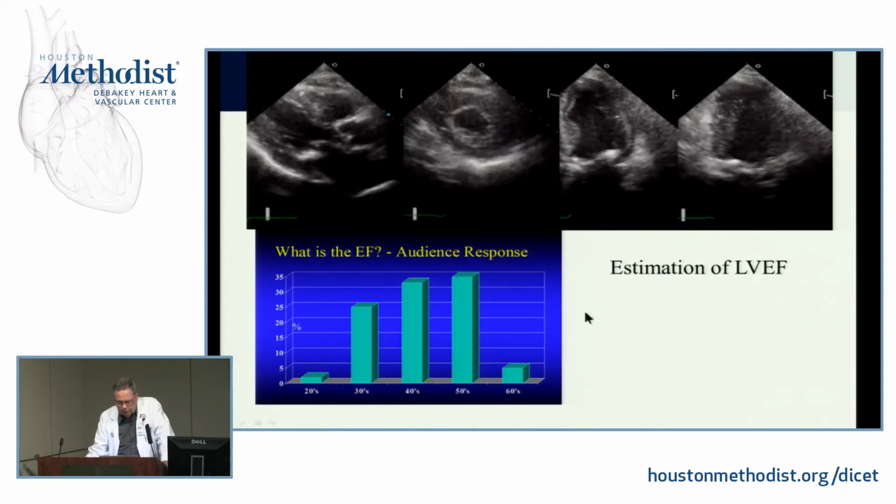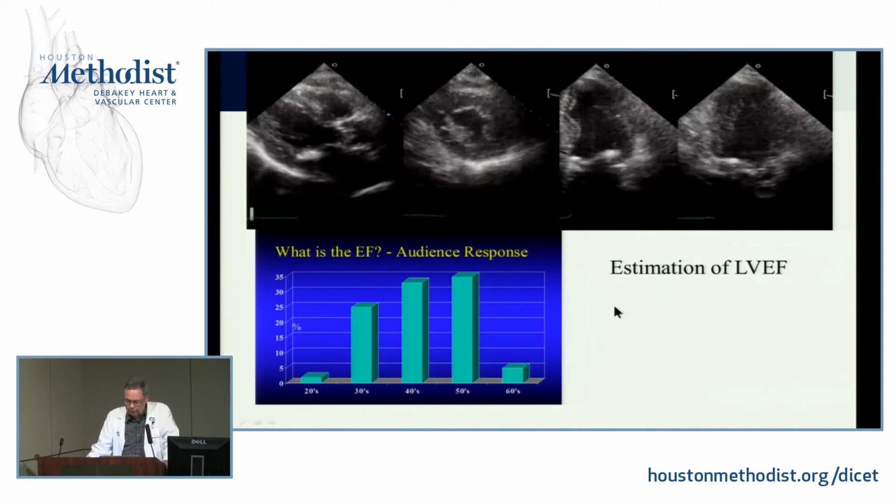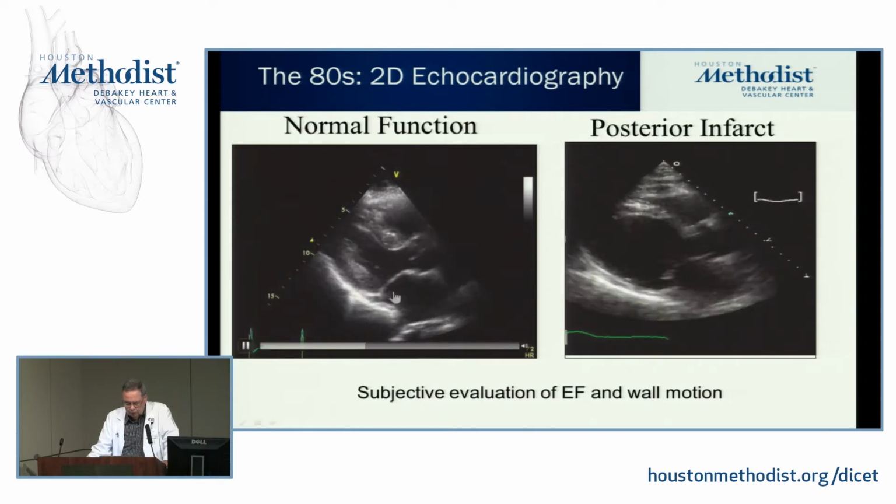You can help yourself a little by looking at the mitral valve. If the heart is a big heart, how much the valve opens and gets close to the septum can be a nice indicator. If we go to the previous case, you see that this valve opens and there's a big gap between the maximal opening and the septum compared to this one here.